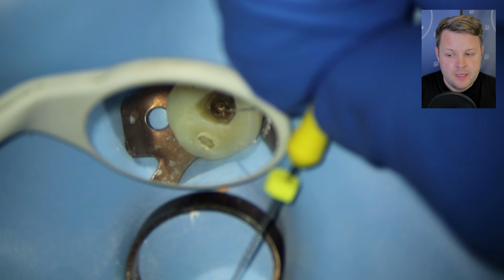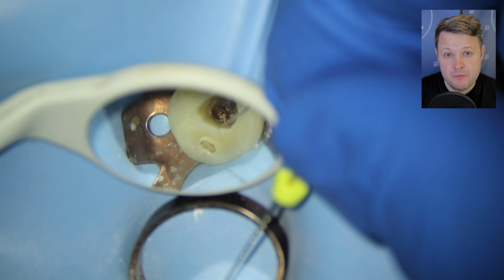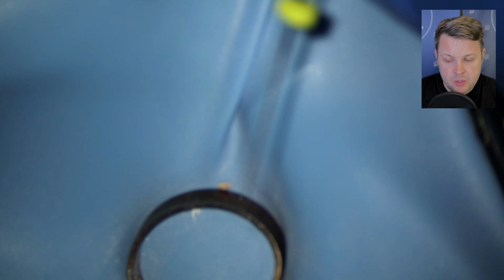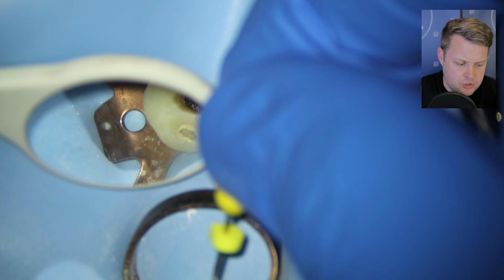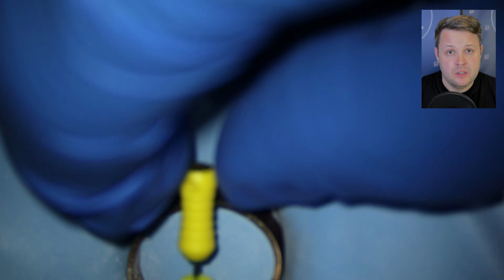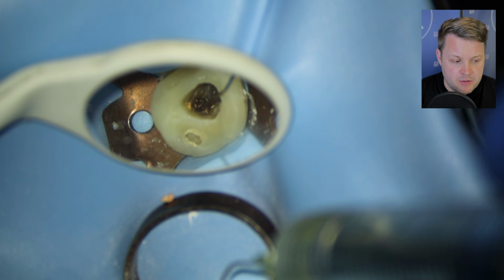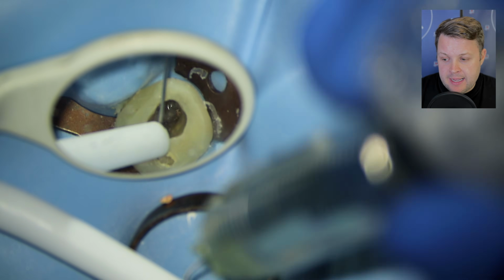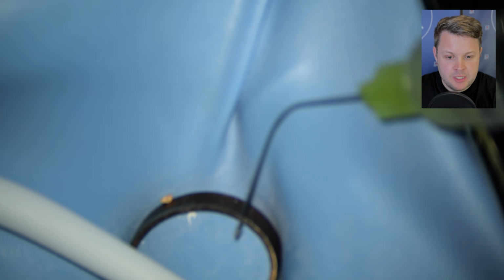treatments, because I don't know how other people feel, but sometimes I get too focused on things, and then 10 minutes turns into 2 hours, and then you've wasted the whole appointment. So it's just important to think about looking at the other canals and going back to the canal space that you're having trouble with. Obviously irrigant is going to be flowed down that canal for a decent period, and sometimes when you're using the irrigant, this can open up the canal space and you can negotiate.